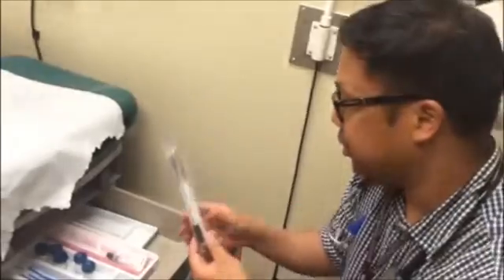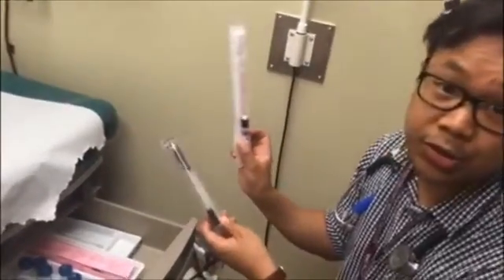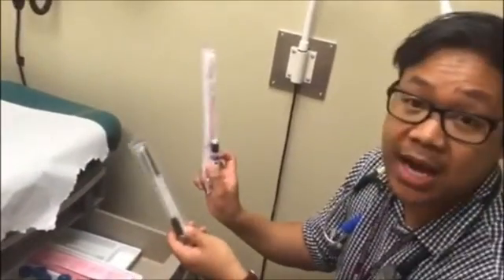You have this black and white swab, which is for a vaginal swab. And you have the pink swab, which is for chlamydia and gonorrhea. So depending on what you're doing, you might not use either, or you might use one or the other. Set those up, the side there.